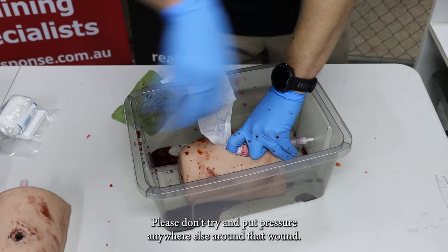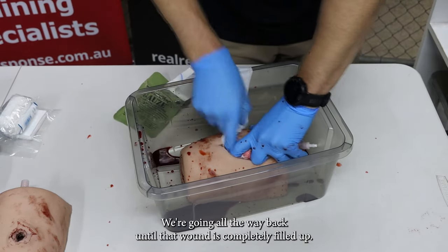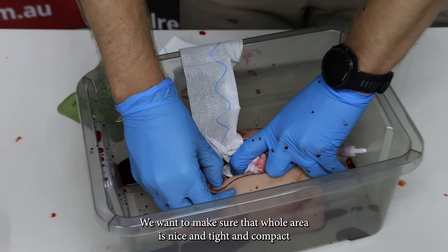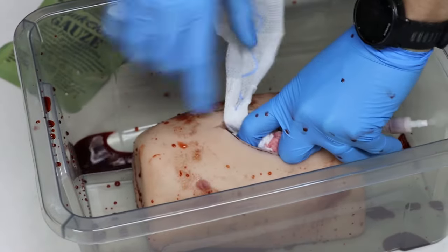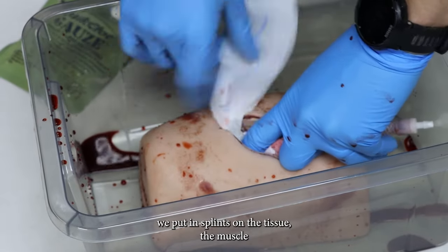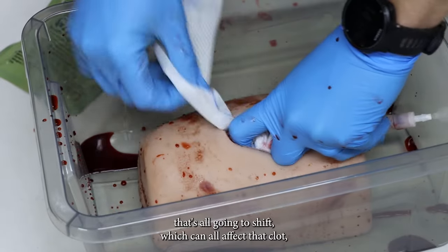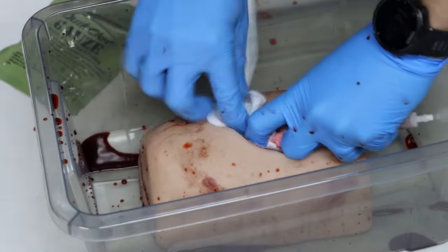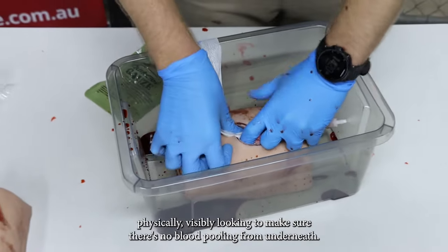Please don't try and put pressure anywhere else around that wound — we're going all the way back until that wound is completely filled up. You can see there's a lot of space to fill up. We want to make sure that whole area is nice and tight and compact, because when we start to move our patient, if you're putting splints on, the tissue and muscle are all going to shift, which can affect that clot and might cause it to blow or move, causing that patient to bleed again.